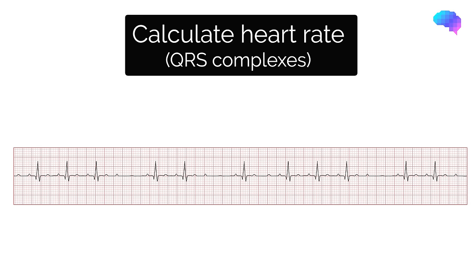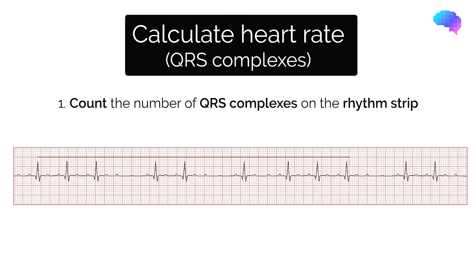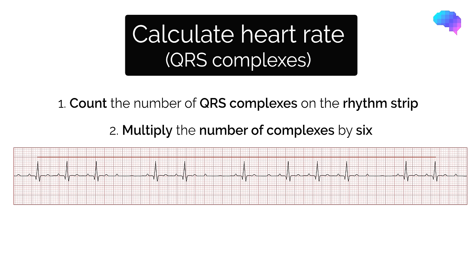This second method is useful when the heart rhythm is irregular. In this situation, we can't use the RR interval method as the RR interval will vary. To use this method, you need a standard ECG strip, which is typically 10 seconds long or 50 large squares. Count the number of QRS complexes on the rhythm strip, then multiply the number of QRS complexes by 6, giving you the number of QRS complexes within one minute. In this example, we have 11 QRS complexes, therefore when we times this by 6 we get a heart rate of 66 beats per minute.